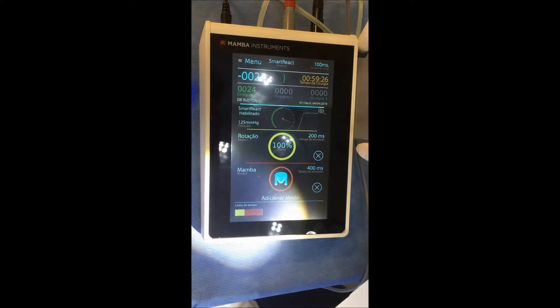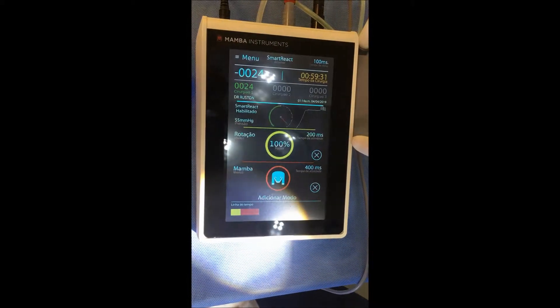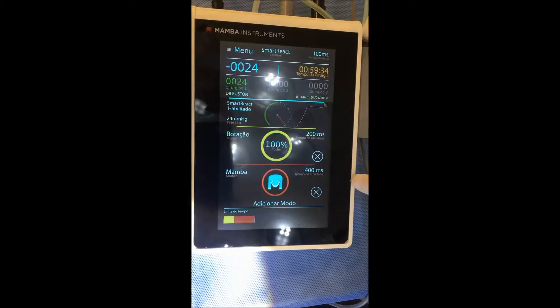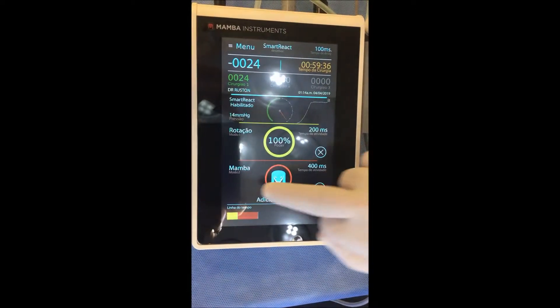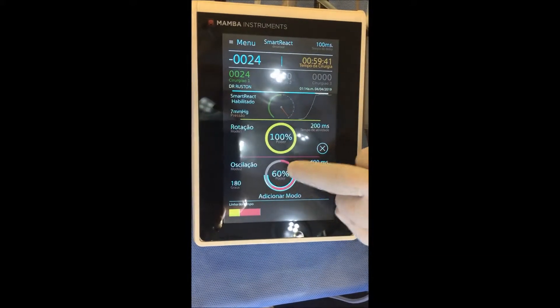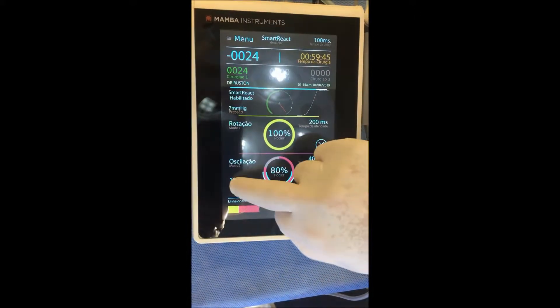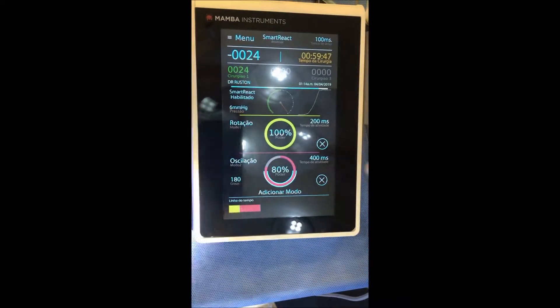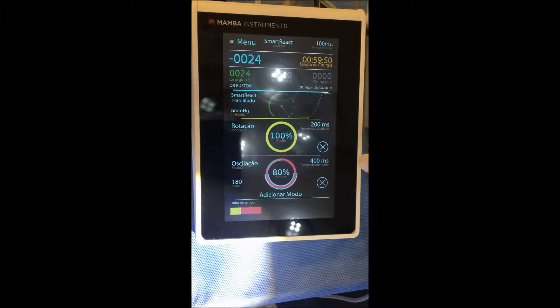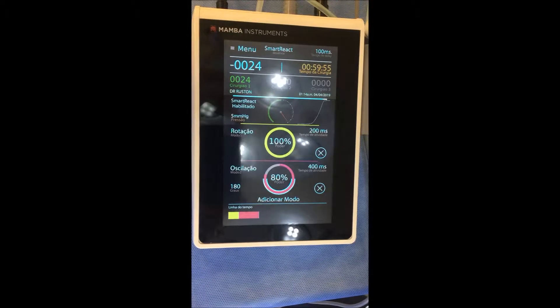The first settings I suggest would be rotation 200 milliseconds — enough to penetrate the skin — and after that, oscillation from 60 to 80% at 180 degrees angle. This setting is more conservative, so you have a lower chance to damage the graft or cause partial transection.